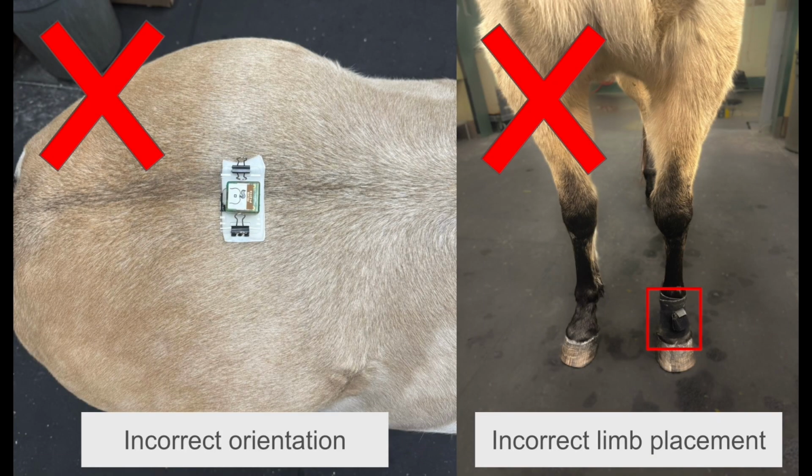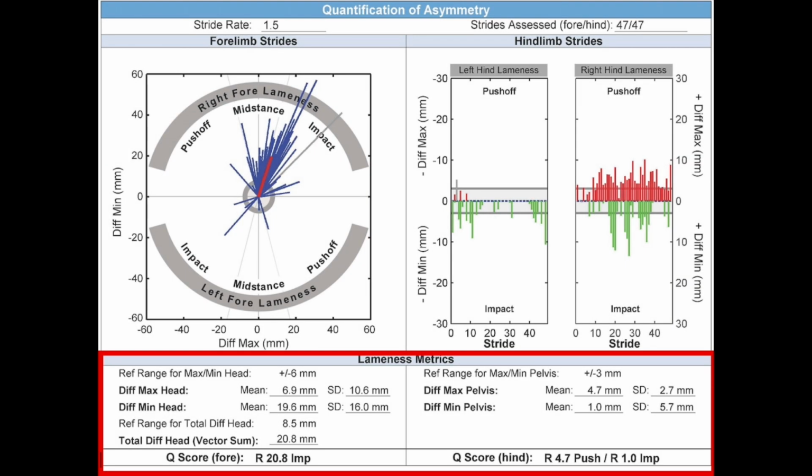Errors in data collection can occur if sensors are placed in the incorrect orientation or off-center, or if they slide during data collection. A standard deviation of the diff max that is higher than the mean can indicate stride variation that leads to inconsistent analysis and may require repeat evaluation.